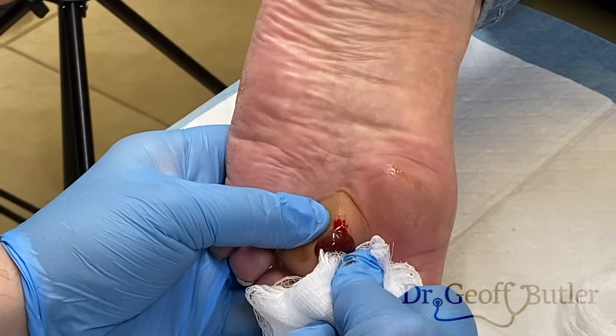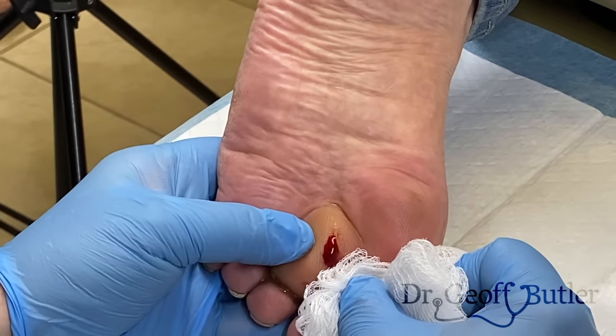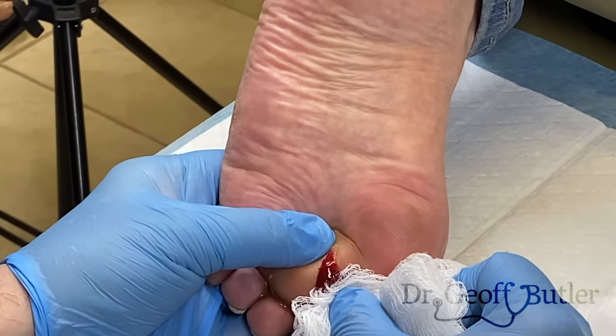So this is why the freezing didn't work very well — it's really uncomfortable for him when this is swollen. You can think to just add more freezing, but you'll make him more and more uncomfortable.